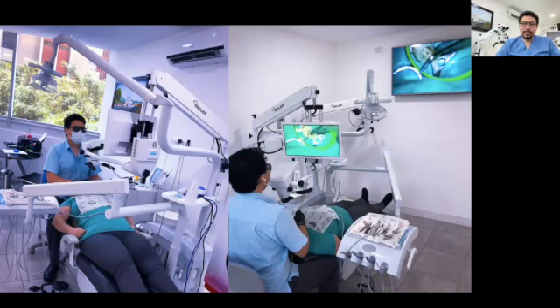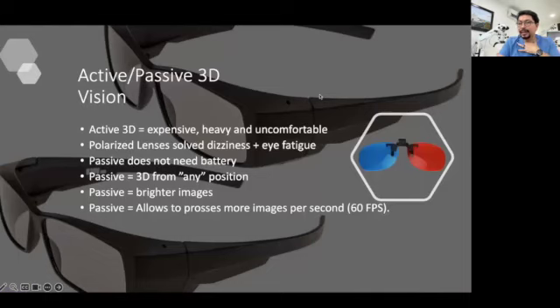And as you can see, look at the position of this patient. The position is not the best position, because the patient is inclined at about 45 degrees, because this patient was experiencing some back problems. Look at my position. I still have a proper and ergonomic position, even with that angulation of the patient. Why? Because I have the screen in front of me and I was able to angulate the optical pod of the 3D microscope in the direction that I need.